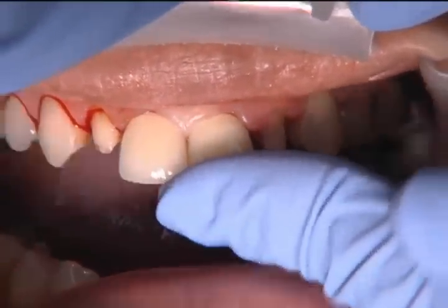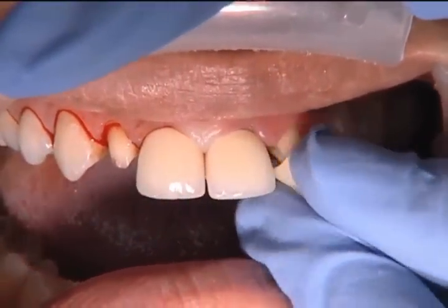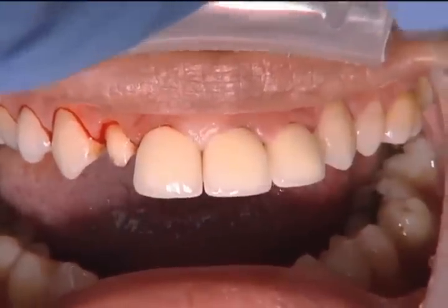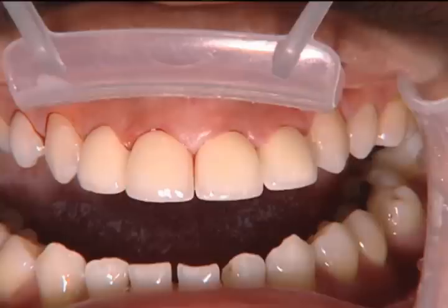This is another reason I want to use a product like Clinical Zirconia — we want the aesthetics of an all-ceramic but we need to be able to cement it. There's obviously no way we could bond into that kind of area with that kind of bleeding, but we've all been able to cement PFMs and conventional restorations successfully into areas that are bleeding.